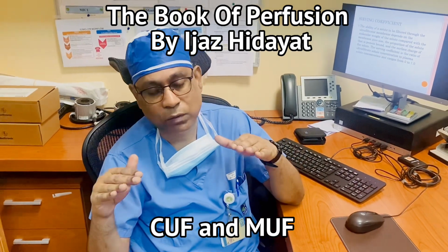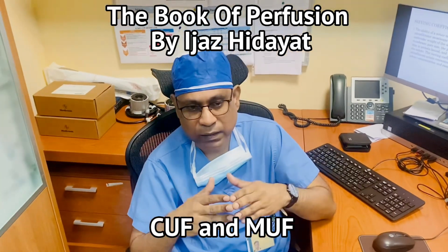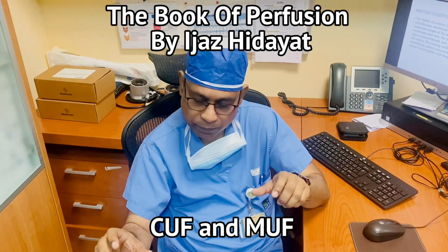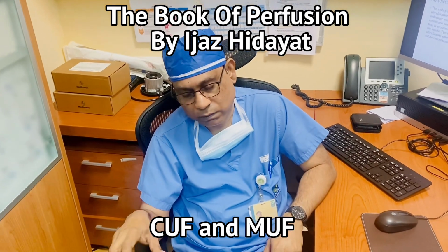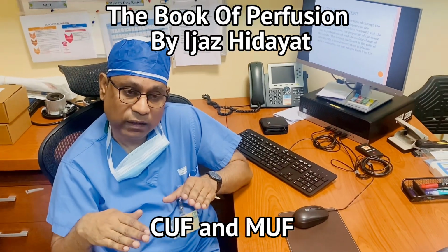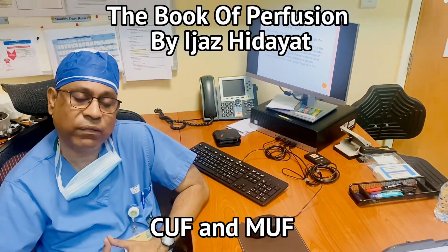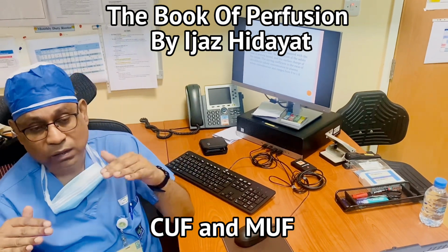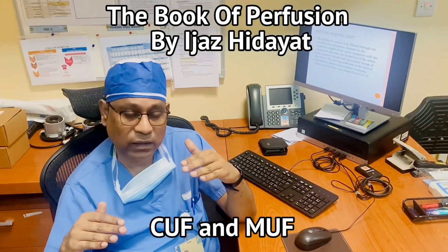The rate of modified ultrafiltration is about 30 to 50 mL per minute, and during modified ultrafiltration we run the main arterial pump. For example, if the flow of your main arterial pump is 50 mL per minute, then we set the MUF, modified ultrafiltration pump, at 60 to 70 mL. So the rate of the modified ultrafiltration pump should be higher than your main pump.